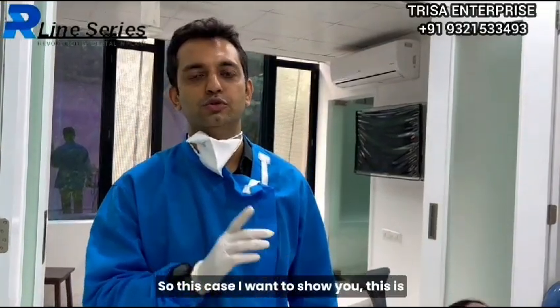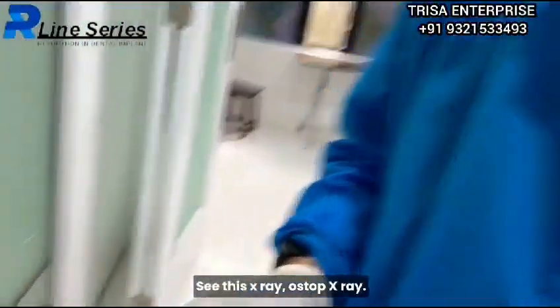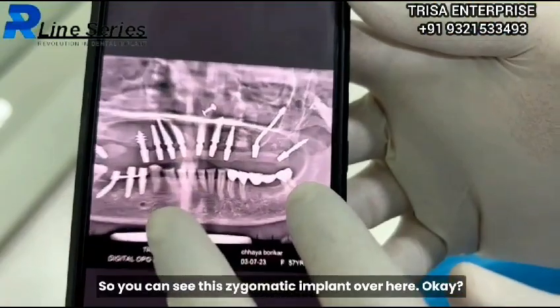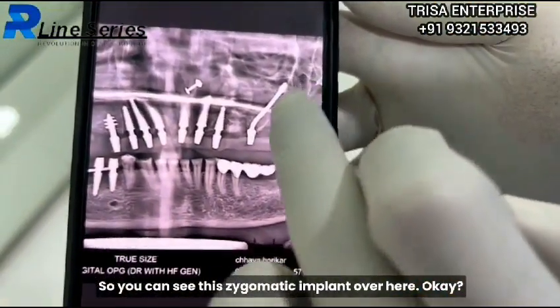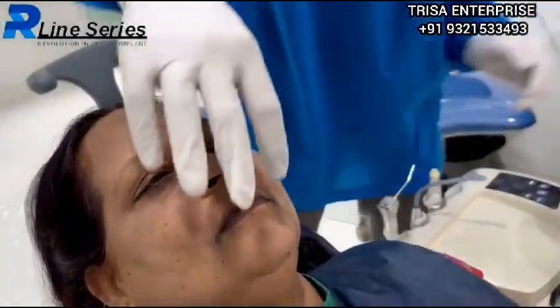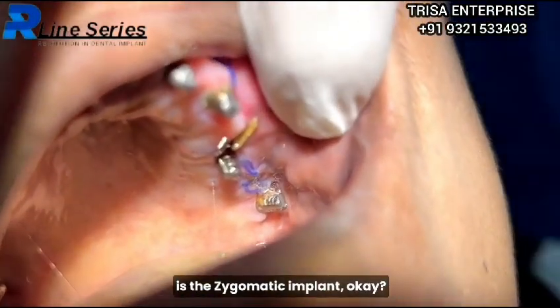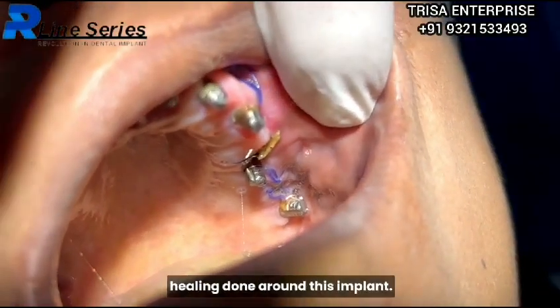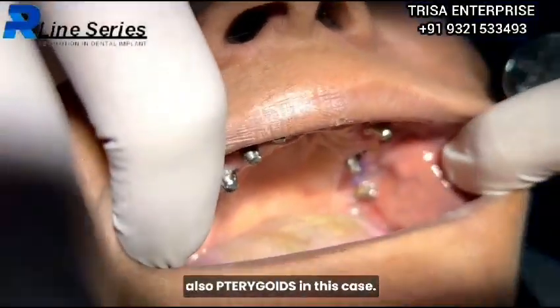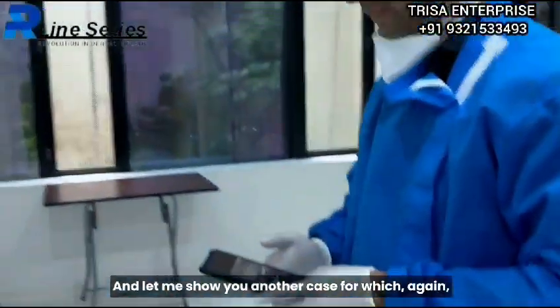This case I want to show you — this is a single-piece zygomatic implant from the R-line series. Come closer and see this post-op X-ray; this is done with the two-hole technique, so you can see the zygomatic implant over here. Let me show you clinically also in the patient. As you see here, this is the zygomatic implant, and you can appreciate the wonderful healing done around this implant.